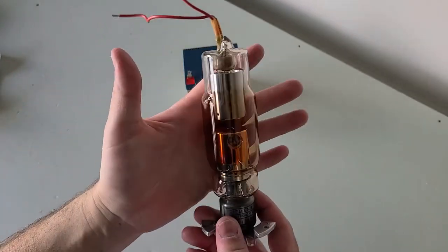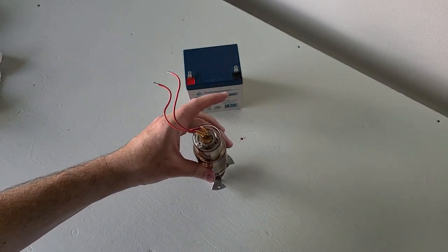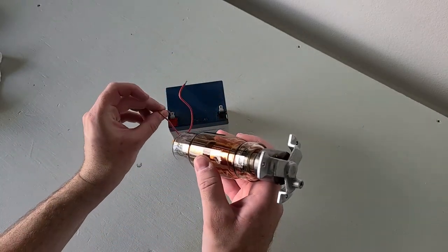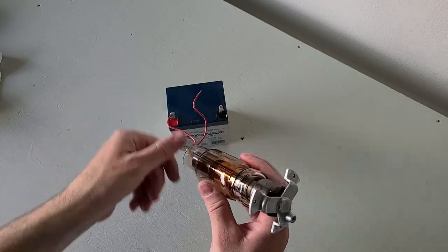That's a pretty cool little tube. I'm going to leave the base on it so I can make a stand for it. Go ahead and stand it up, and you can actually hook it up to a 12 volt battery and make the filament light up. It does not make any x-rays this way, just so you know.